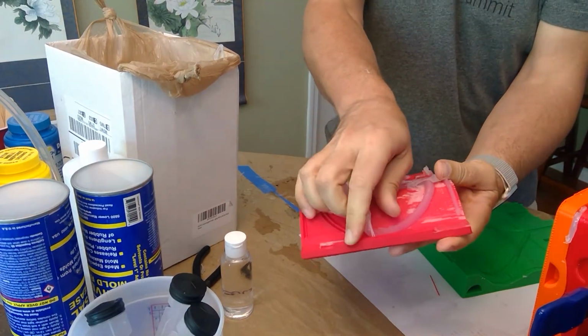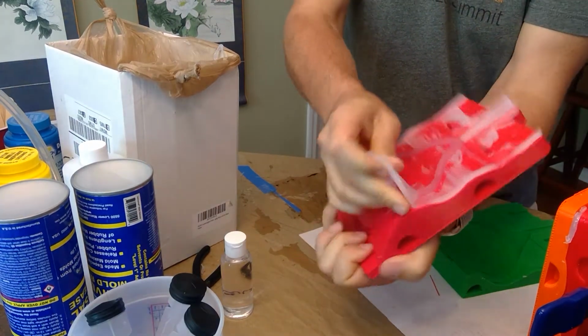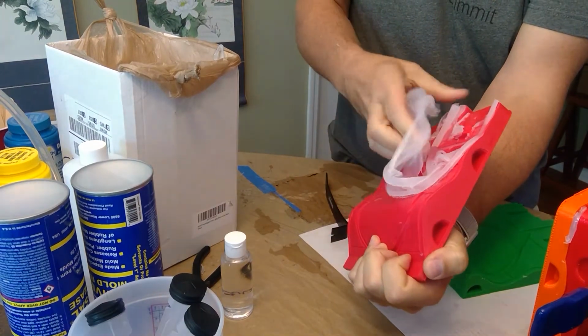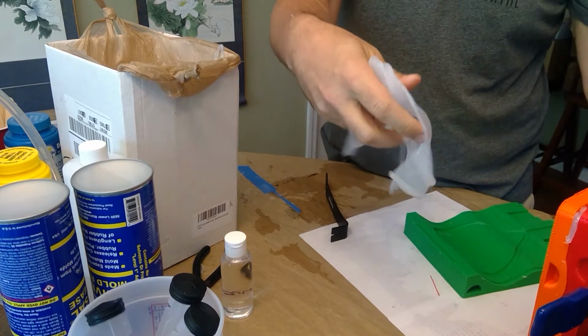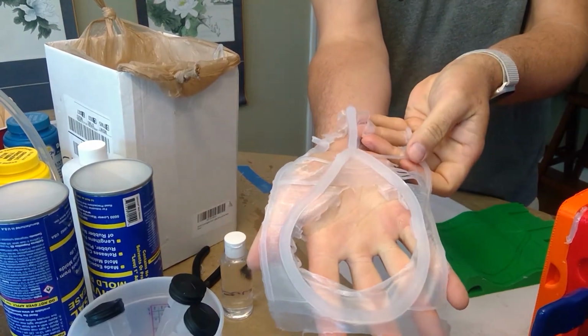The nose bridge is delicate, so you're trying not to add tension to that point anywhere along the way. Once you get it all the way, you pull that out, and then you are left with a completed gasket.